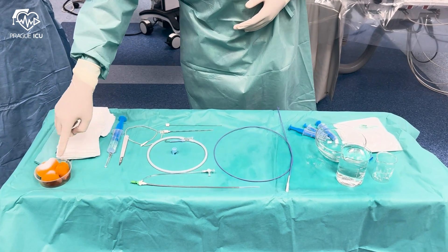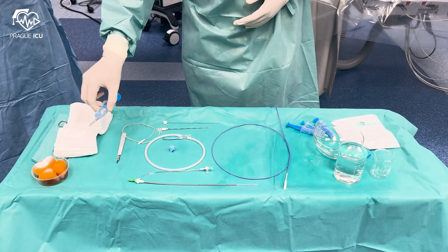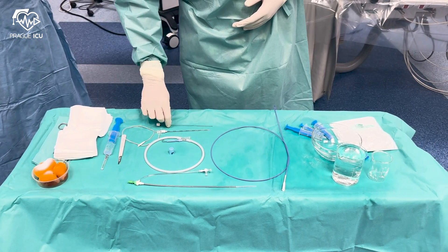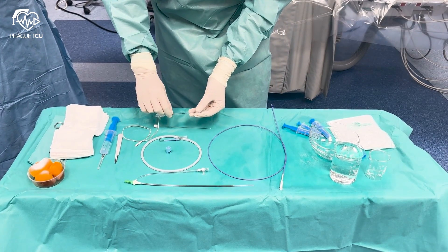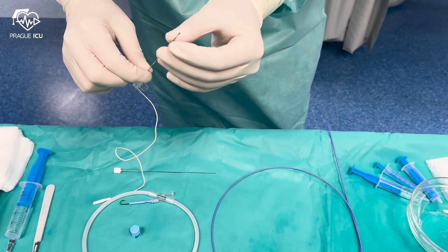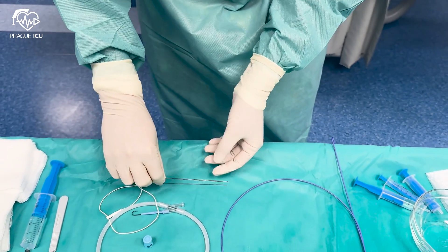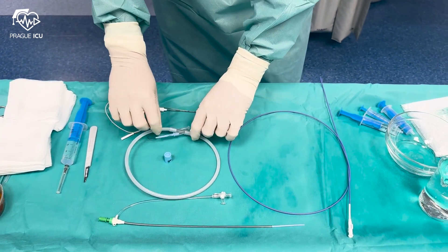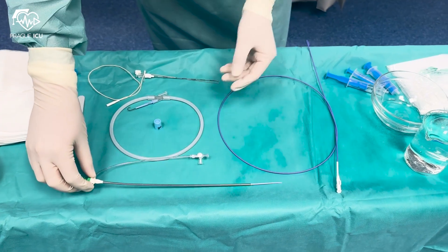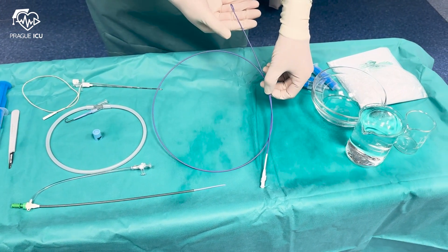On the sterile trolley we have: local disinfection chlorhexidine, a 20 ml syringe with local anesthetic agent, scalpel, a two-orifice aspiration 15-centimeter 18-gauge needle — which has a long curved bevel with a sharp distal tip that is often utilized to safely enter the pericardium — and a 0.035-inch J guide wire.